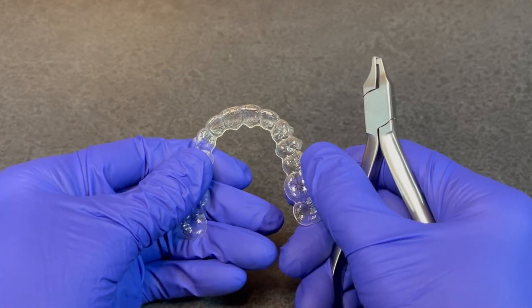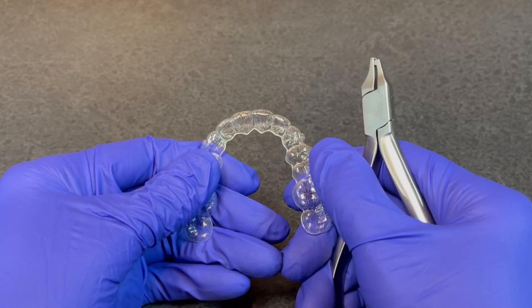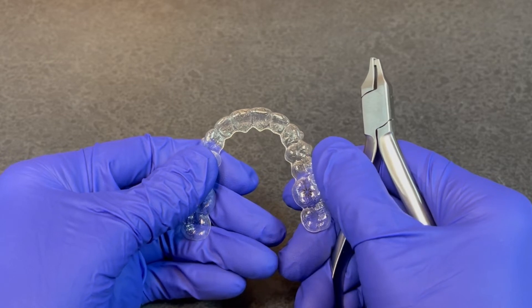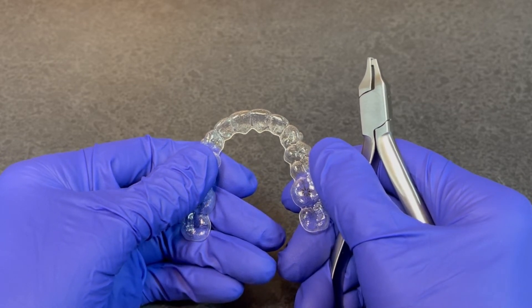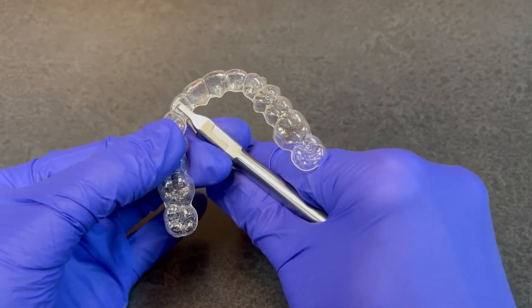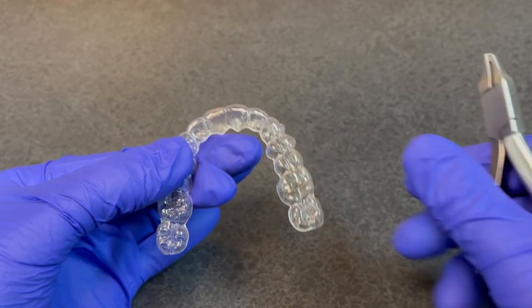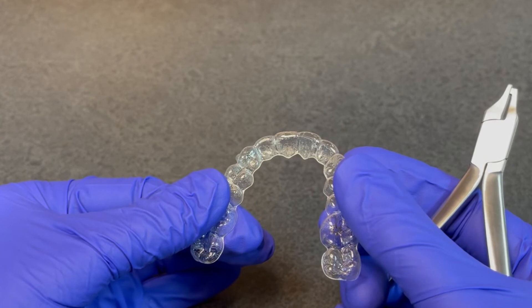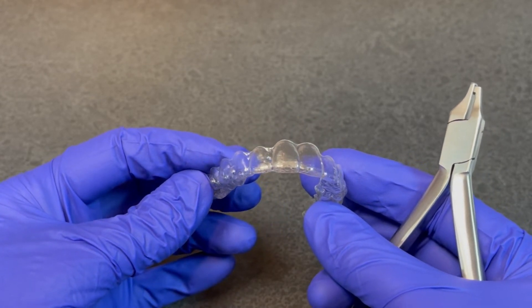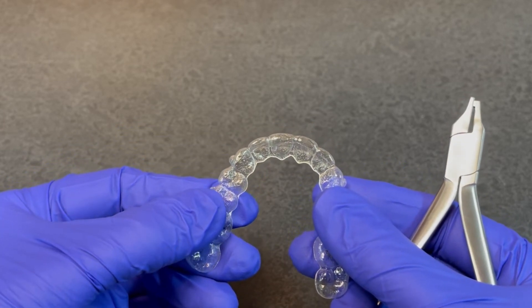Since our intent is to produce a rotational couple for that maxillary right lateral incisor, we're going to use the same instrument — the clockwise wedge — and place an indent at the distal line angle near the embrasure of the lateral incisor. Only gentle pressure is required. We now have one indent on the mesial of the lateral on the facial and one indent on the lingual to complete the rotational couple force.